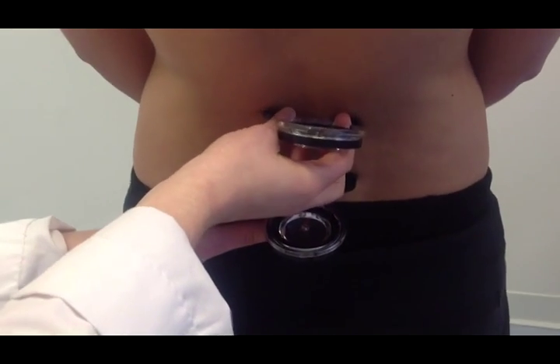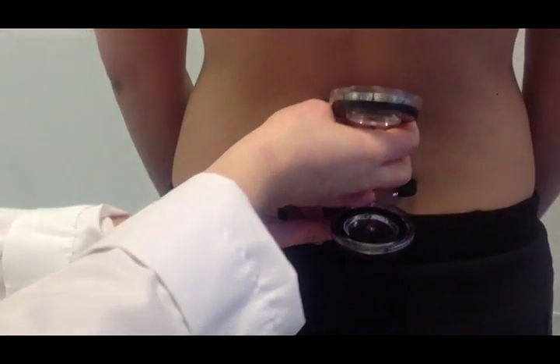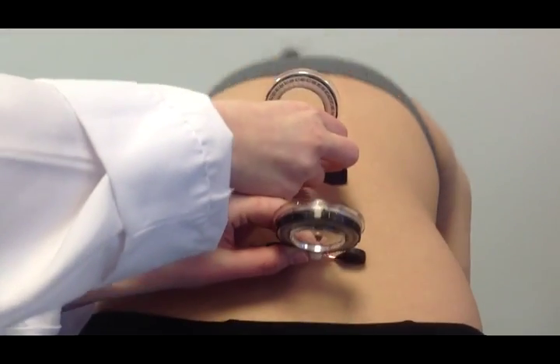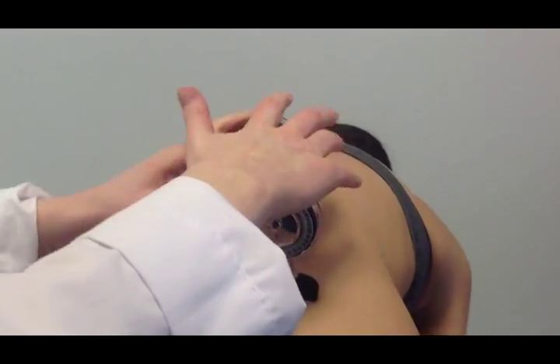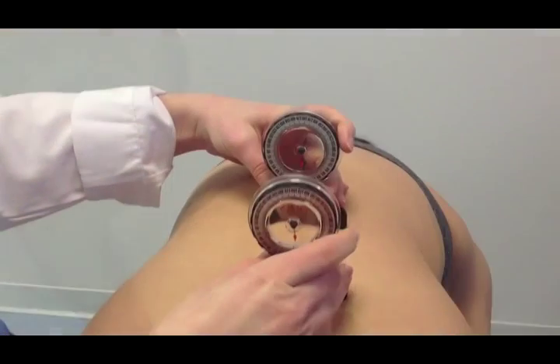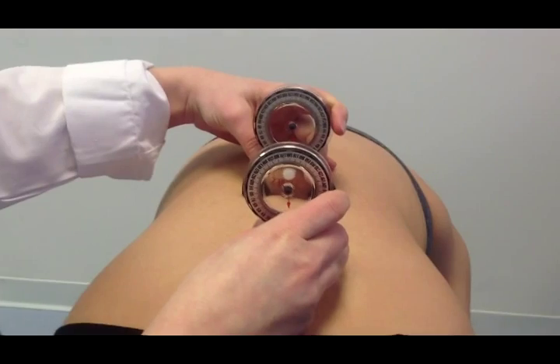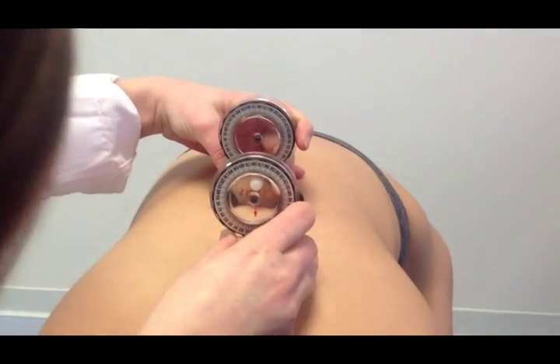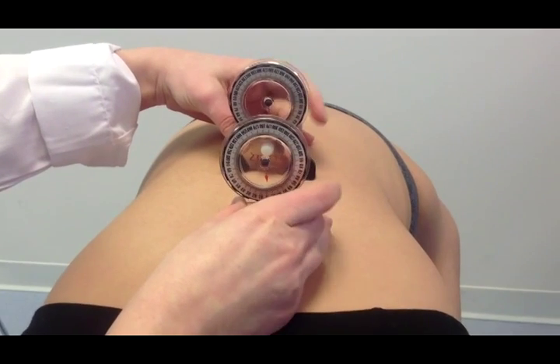Mallory, will you bend at your hips like I demonstrated earlier? The reason you want to have your patient bend is to avoid compensating by side bending at the lumbar spine. Once we have our patient in the test position, you want to go ahead and zero out the inclinometers.